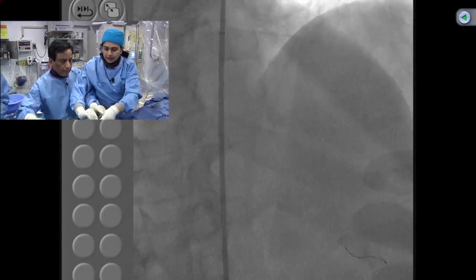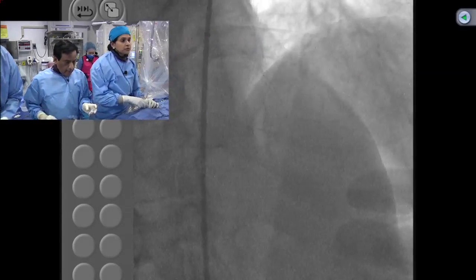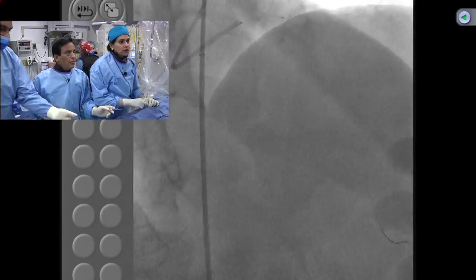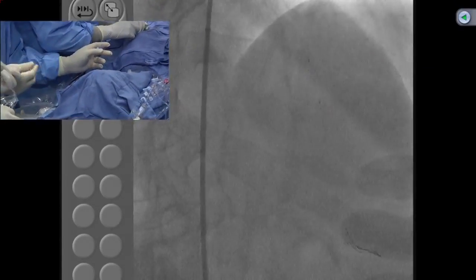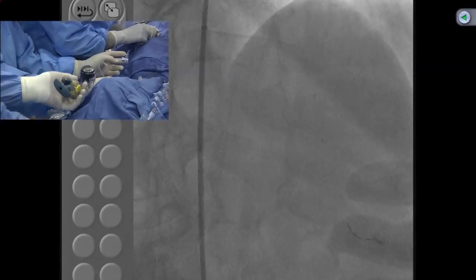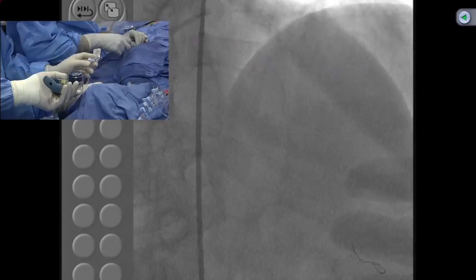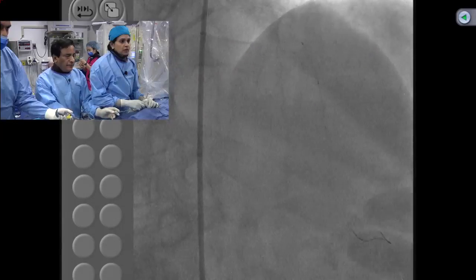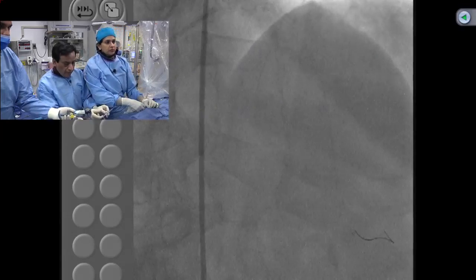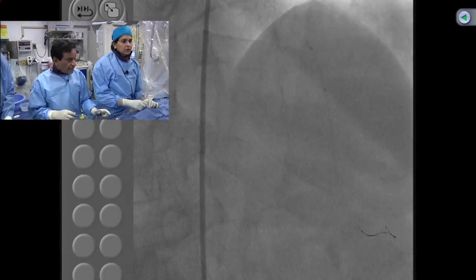We didn't talk about what you chose for the antiplatelet regimen for this patient. The patient is on clopidogrel. Now, more important from the teaching point of view, what made you decide to go with the Progress wire? You went with the Fielder, then the Miracle 6, then Confianza, but what made you go to Progress, knowing that it then kind of slipped through?